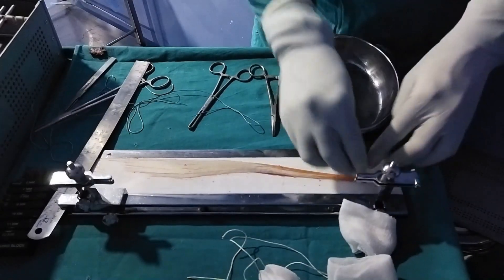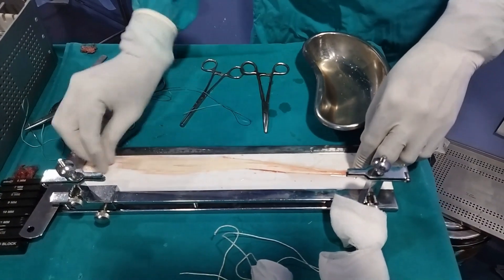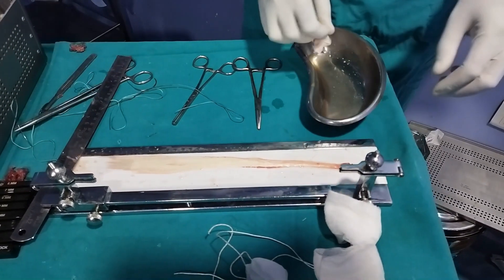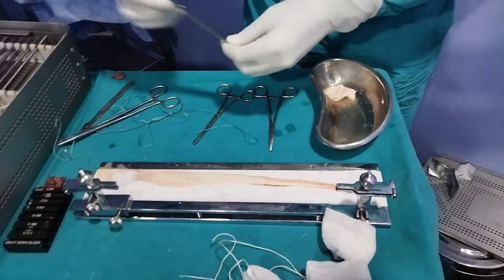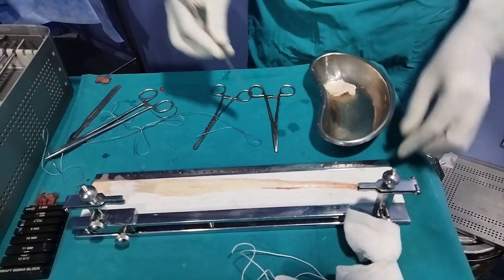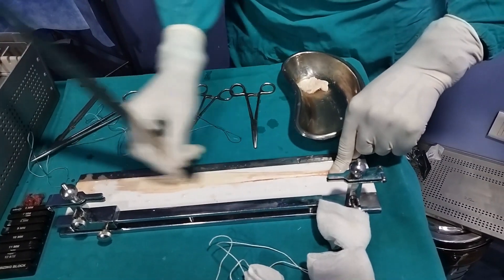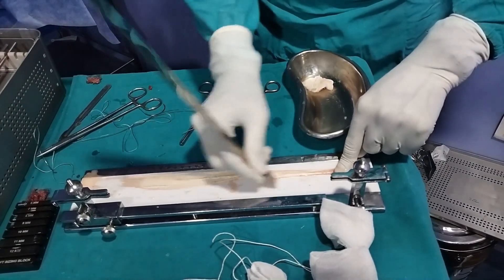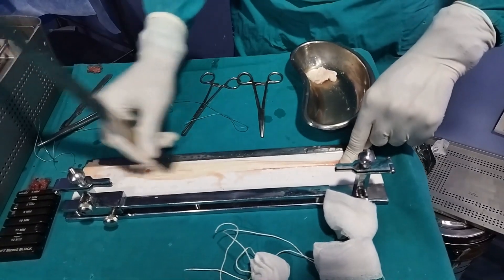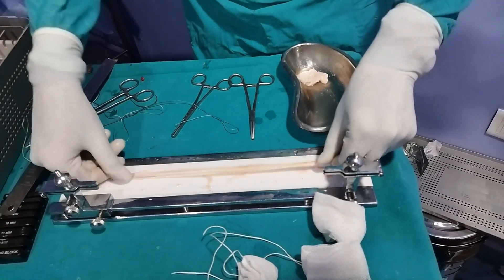Only keep the tendon moist to avoid drying of the tendon tissue. We use saline mixed with vancomycin powder — you can use any antibiotic with local effect such as vancomycin, cefuroxime, or gentamicin — in order to prevent surgical site infection.